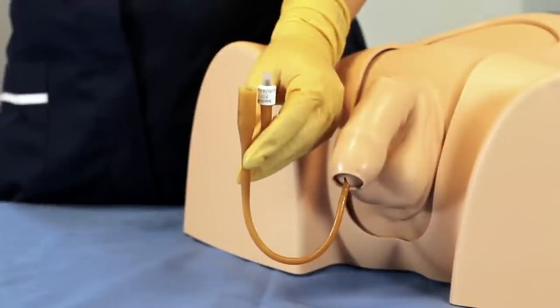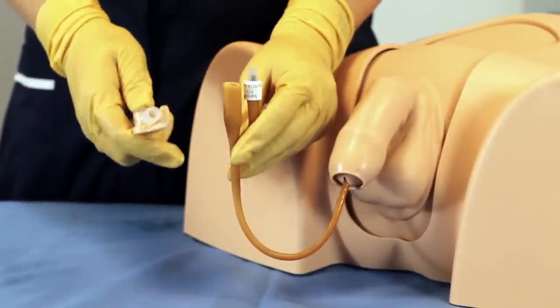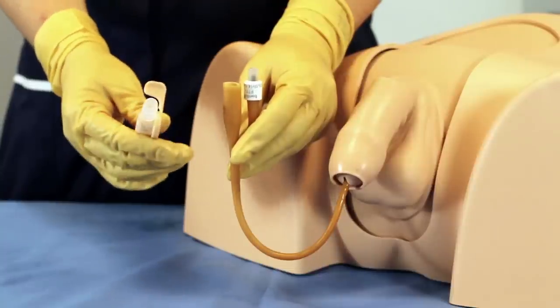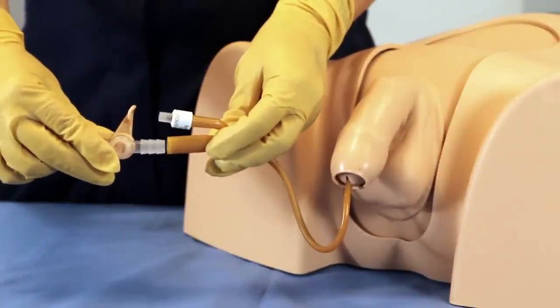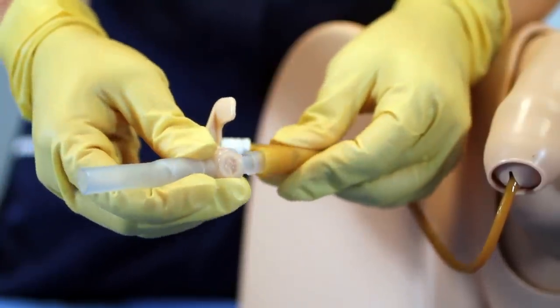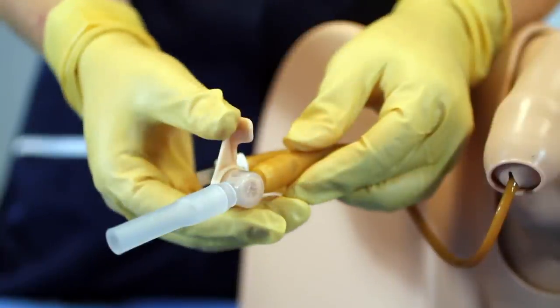Insertion of the catheter valve. Holding the catheter in your left hand, ensuring aseptic technique, take the catheter valve with your right hand and position the lever from open to 90 degree stop position before inserting. Align the ridge connector of the valve to the opening of the Foley catheter, ensuring a tight fit. The catheter should cover all three ridges.